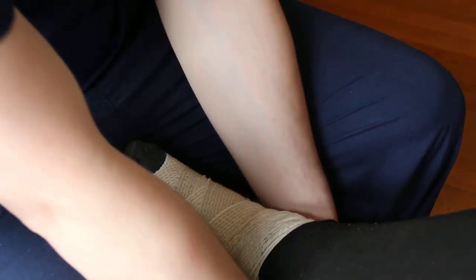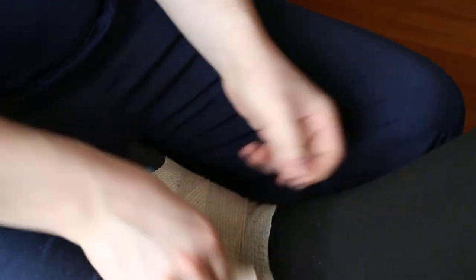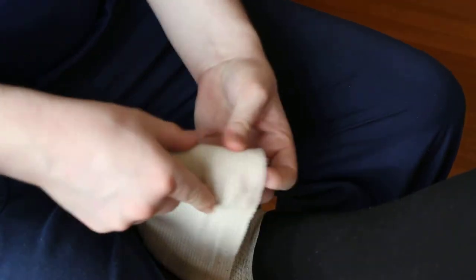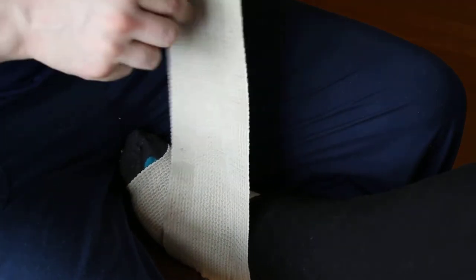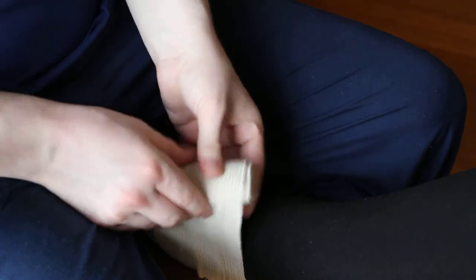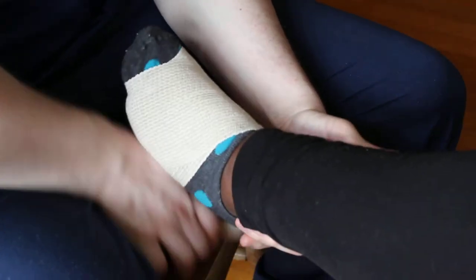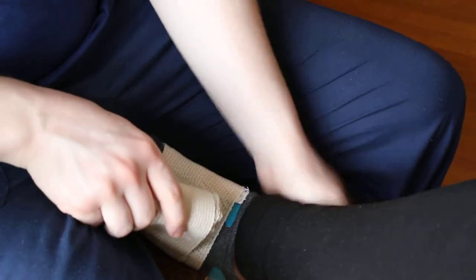Whenever you take your old A-strap off, wash it. You want to wash it. You want to kind of roll it up as you take it off, that way the next time you put it on it's ready. Now these will eventually lose their elasticity and you'll have to buy new ones, but they last usually a couple months depending on how much you use them.